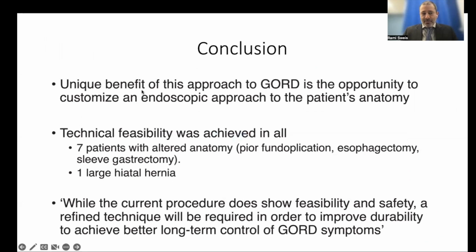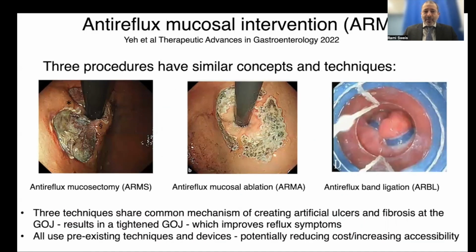The authors suggest that the unique benefit of this approach is that it allows us to customize an endoscopic approach to these patients' anatomy. So it can be used in patients who have previous interventions, such as fundoplication, esophagectomy, sleeve gastrectomy, and even large hiatus hernias.